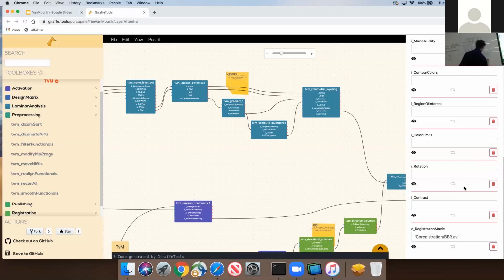And let's just, at the moment, call them layer 1 and 2 and 3, which is not identical to the histological layers in any way. This is just for clarity right now. And the CSF layer. And we can represent that as a vector.